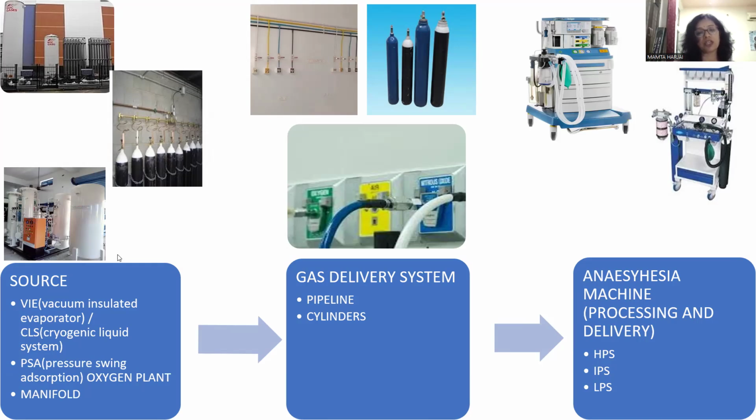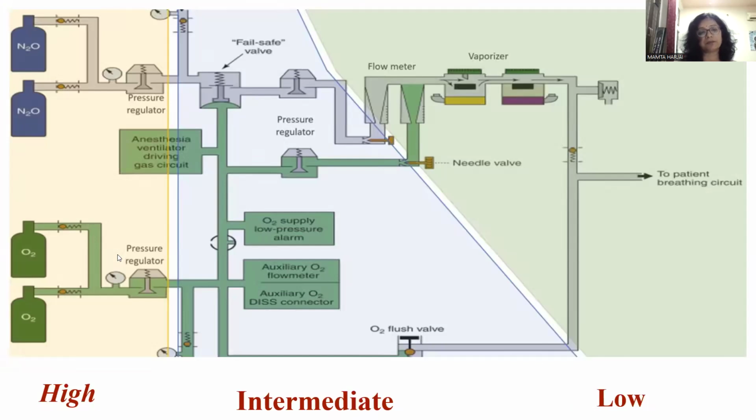Cylinders are the containers which store gases in either liquid form or gas form or in both states, depending on the physical properties of the gas. The gas is then supplied to the various terminal units in the OTs and wards through pipeline and cylinders.